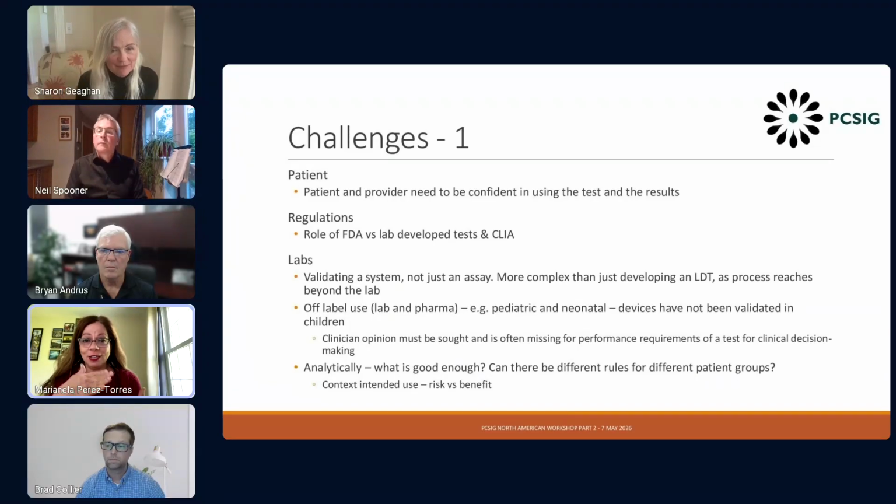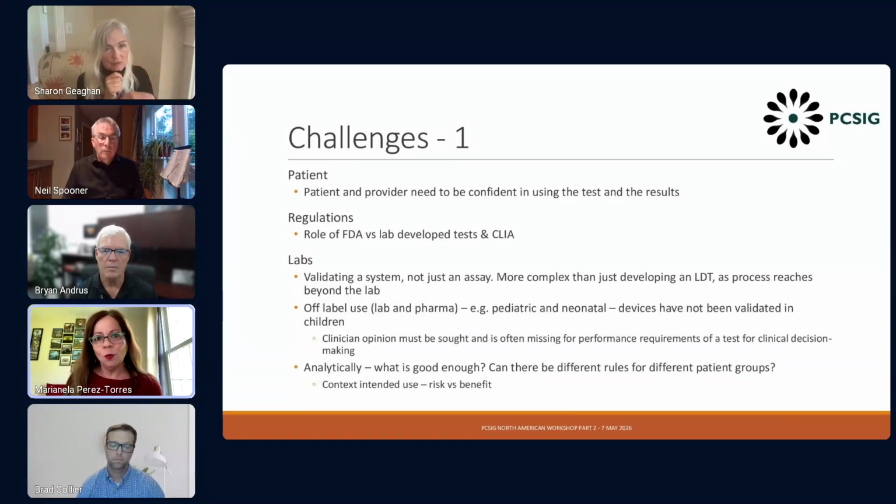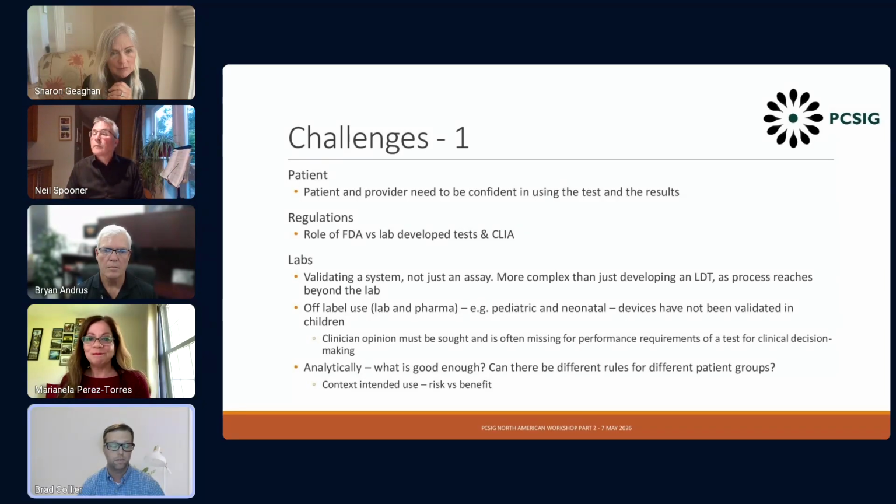If the sample collection devices are medical devices, they need FDA authorization. If we start there, authorizations that include use very broadly for self-collection, such that labs can implement such devices with tests that are also FDA authorized for such uses, that will lessen the burden to the labs regarding their verification activities. I agree. I think, as you and Bryan said earlier, it is a system, and the more clearances that components of those systems have, it makes the approval for the lab to verify and validate that system much easier.